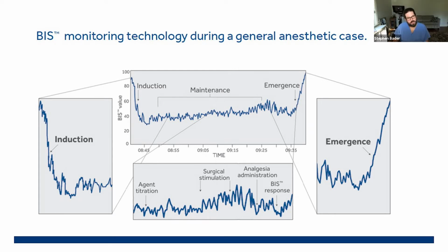And then you start messing with your anesthetic to try and compensate for those hemodynamic changes. That's where most of us think of the BIS as adding extra value. Traditionally we would use just hemodynamic parameters and physical signs of the patient to try and decide if they were light, appropriately anesthetized, or too deeply anesthetized. So if you look at things like lacrimation, the patient's tearing or sweating, tachycardia, hypertension, all of those things are signs that the patient may be light.